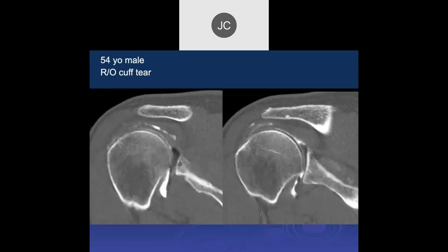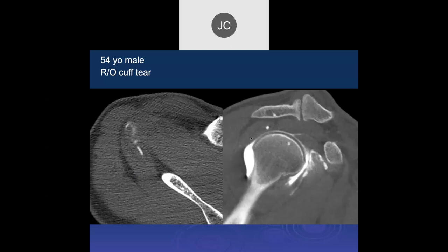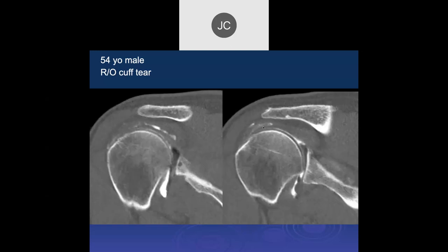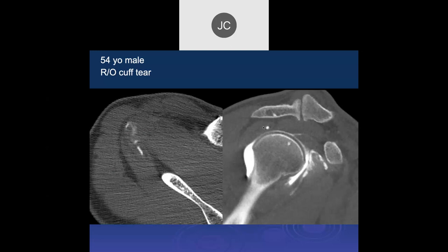Another longitudinal tear — this is a CT arthrogram. Arthrogram contrast extends into the substance of the supraspinatus to the musculotendinous junction, meaning there's at least an interstitial tear that communicates with the joint. This is the same finding on CT arthrogram — we rarely see these, but it's what you'd expect.